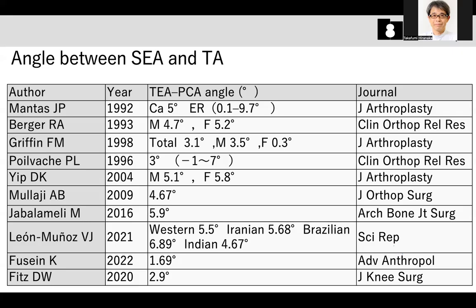So it is quite safe to cut in 3 degrees of external rotation in all cases. But basically, mechanical alignment is a non-anatomical operation, so this difference doesn't matter.